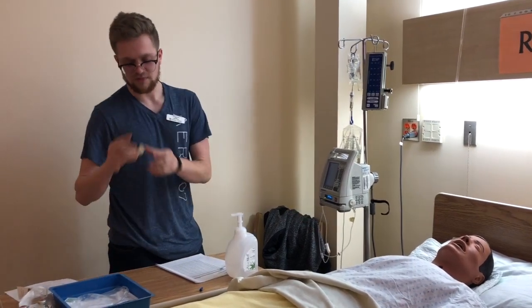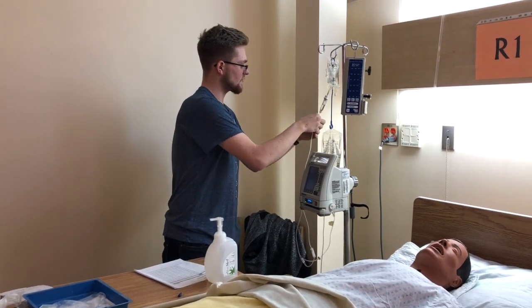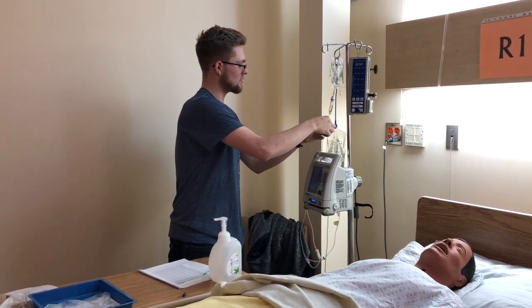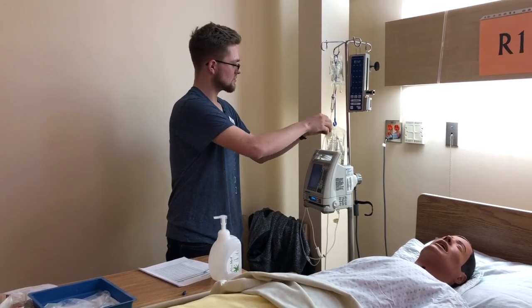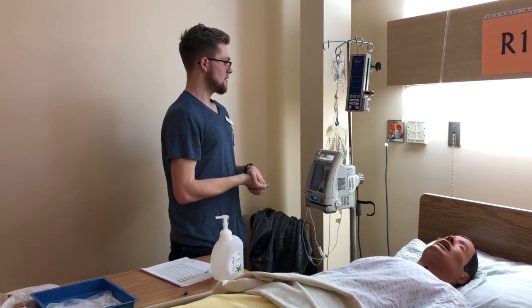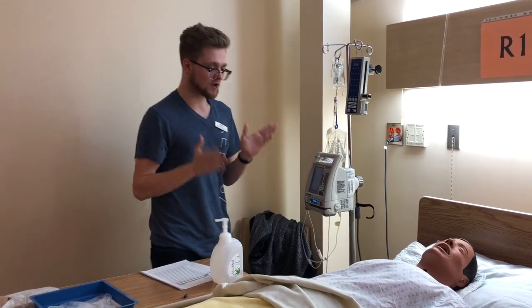And at this time also we want to make sure that we attach this bad boy on here. And then we also want to look for our 3 drops there. So I've already seen 1, and you want to look for another 1, 2, and there's 3. So now that we know it's working, we'll just talk to the patient.